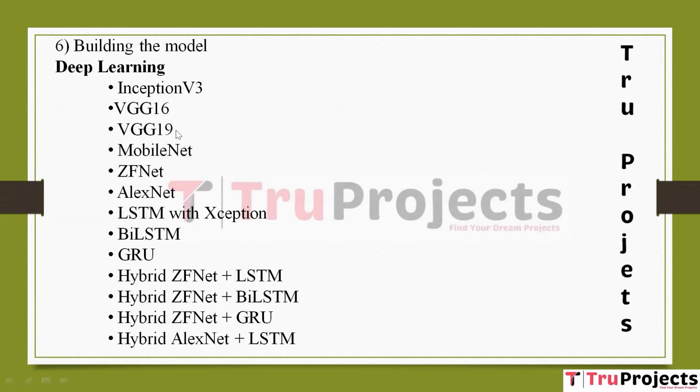VGG16 and VGG19. VGG16 and VGG19 are famous CNN architectures characterized by their deep network structures with a series of convolutional and max pooling layers. They excel at feature extraction from images. In this project, VGG16 and VGG19 can be utilized to analyze ECG images and identify patterns related to sleep apnea.